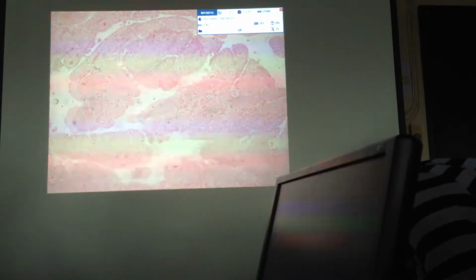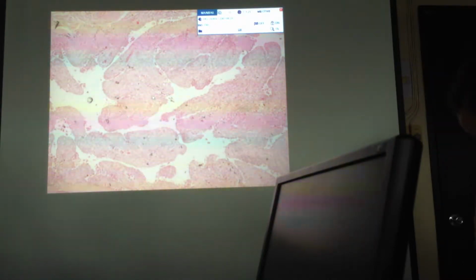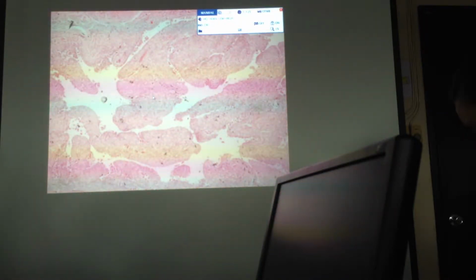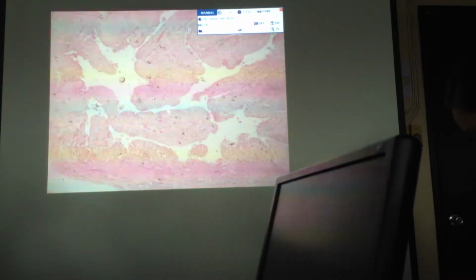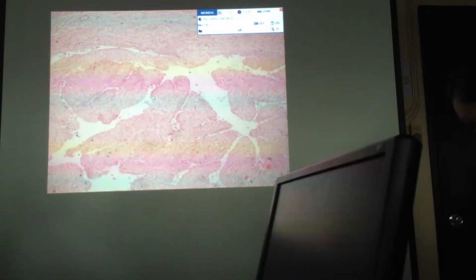Okay? So, in acute salpingitis, this is part of the pelvic inflammatory disease or the PID, okay, wherein there's inflammation of several organs found in the female genital tract. Okay? And this is attributed usually to sexually transmitted disease like Neisseria gonorrhea and Chlamydia trachomatis. Yun yung usual na dalawang culprits. So there's inflammation of the plicate, okay, of the fallopian tube.